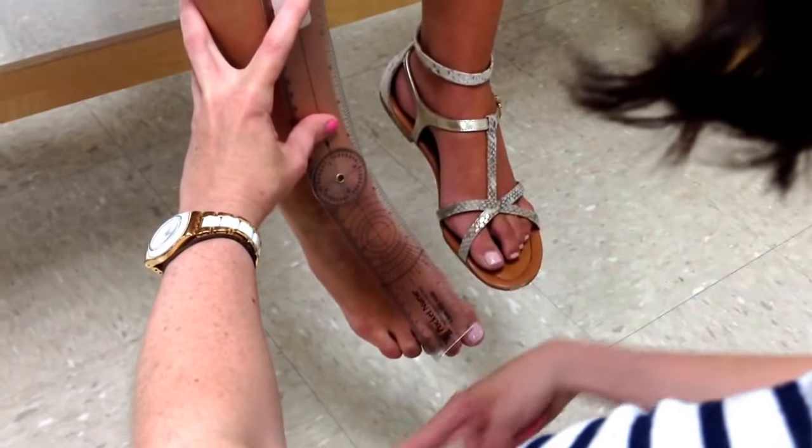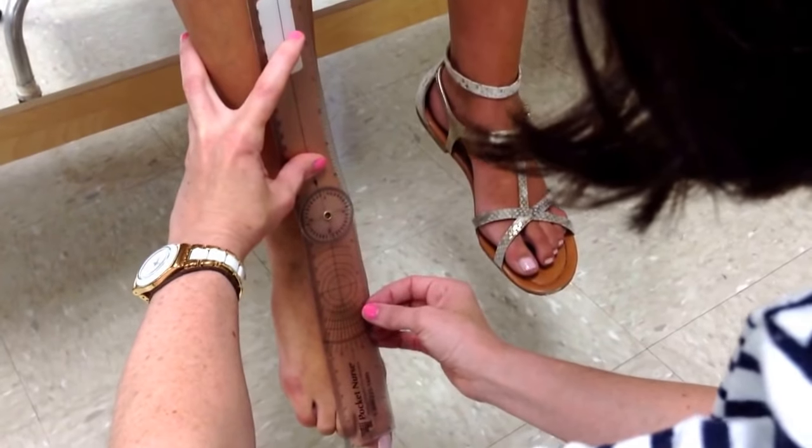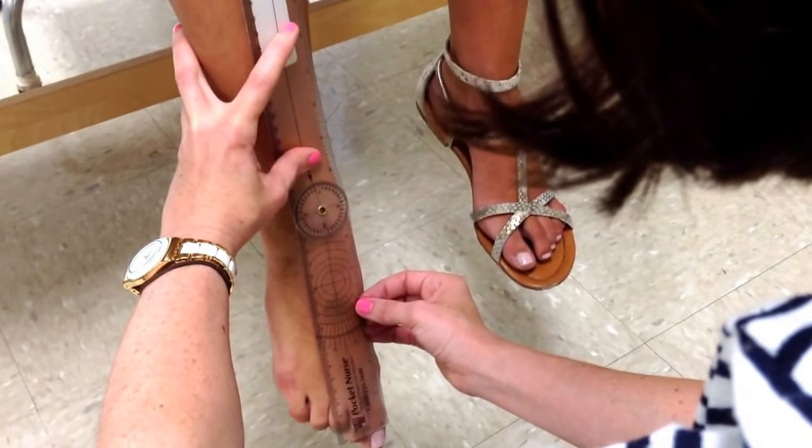For eversion: I want you to bring your toes out in the other direction. Again, the moving arm lines up with the second metatarsal. She's got about 10 degrees of eversion.